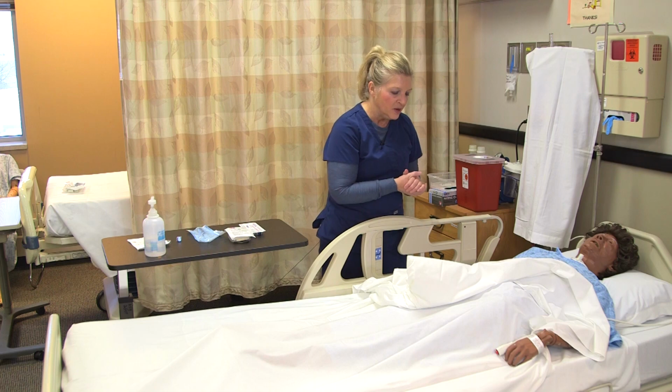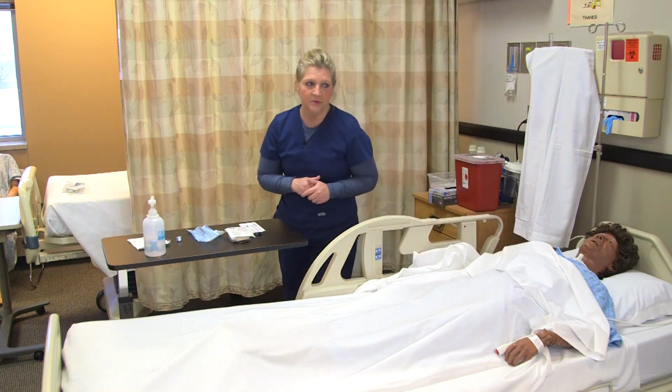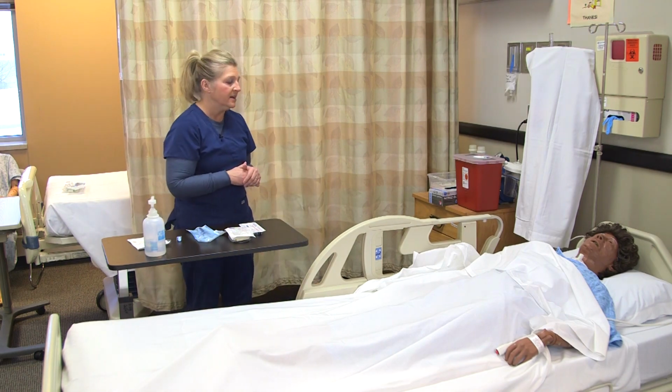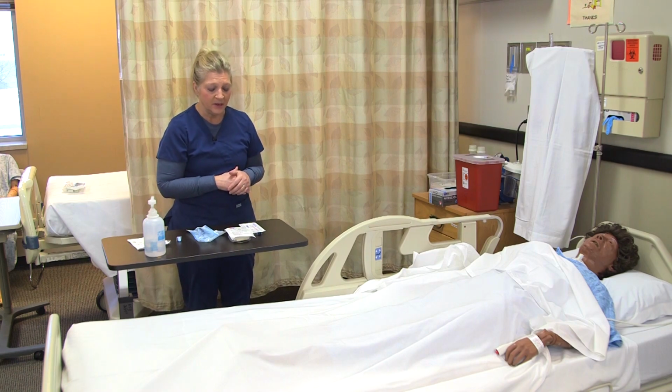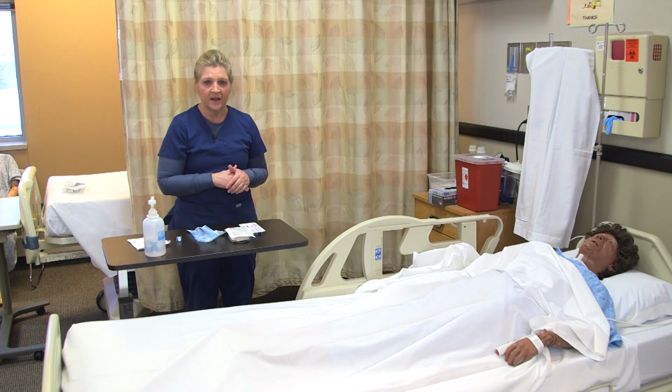have the right patient. Once you determine you have the right patient, you again are going to review the practitioner's order or prescription in the EMR. Once you verify the prescription in the EMR, then you can go ahead and also look at the patient's indication for having the IV started.